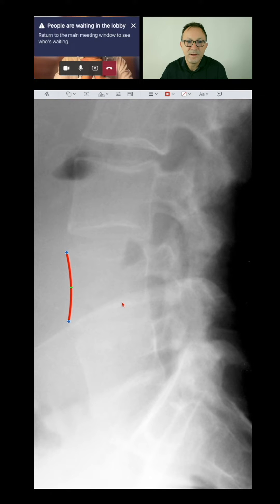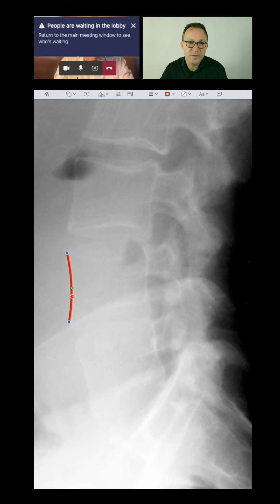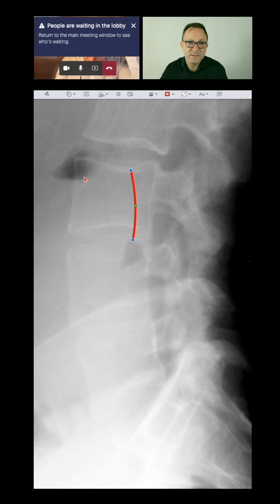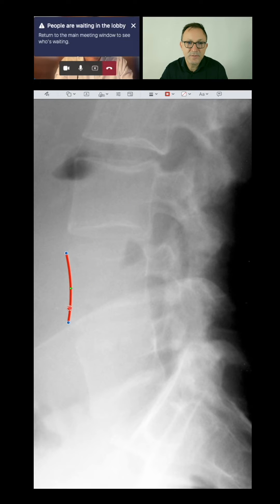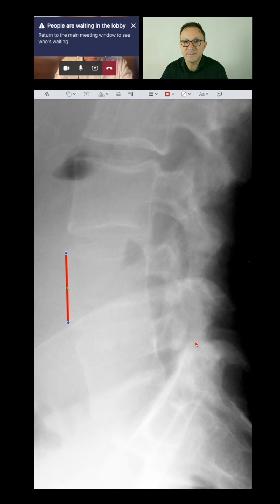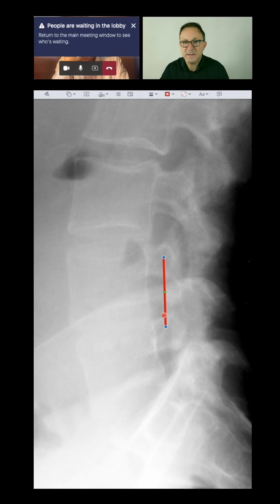So that is the normal vertebral edge. If you compare it, it's a bit of a curve here and also here. Squaring means that this curve goes away and becomes a straight line. So this is how squaring is defined. And I don't see squaring here — it is still somewhat curved. So I wouldn't say there's any periosteal new bone formation at this point.